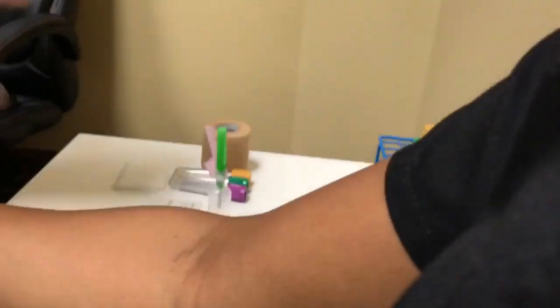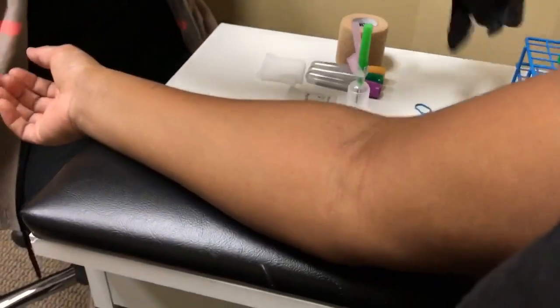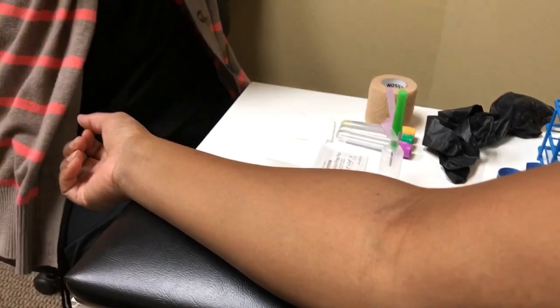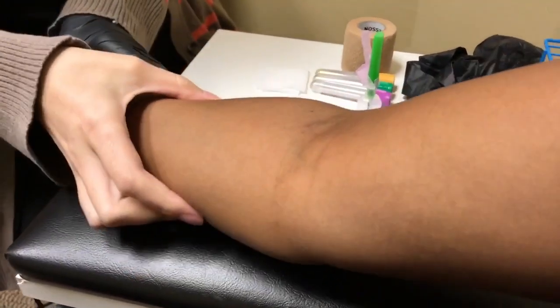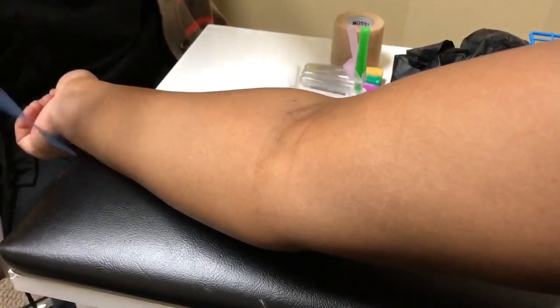I almost forgot a really important part — gloves, hand protection. So I'm going to take a look at her arm. I'm going to put the tourniquet on and see what we're working with.